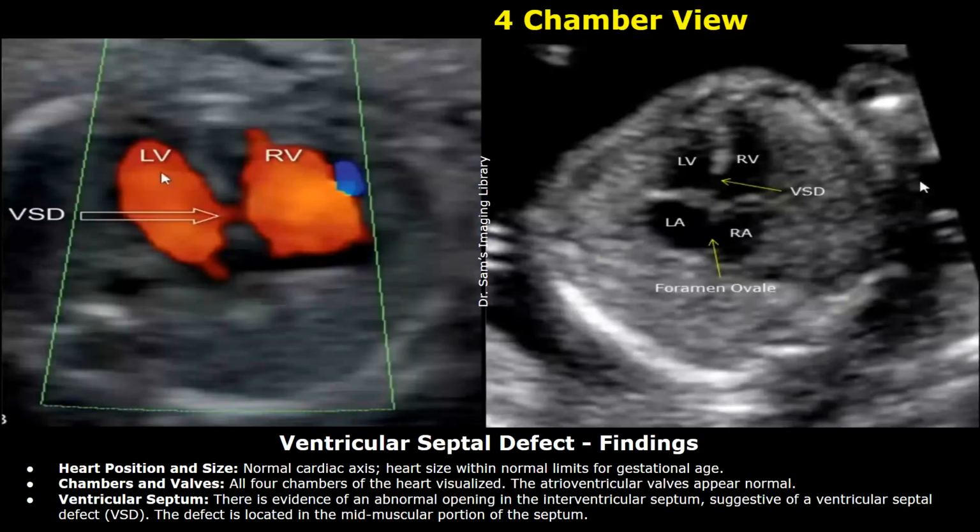You will learn how to write ultrasound reports regarding fetal chest pathologies. The reports will include the findings and the impression. Our first report is of ventricular septal defect.